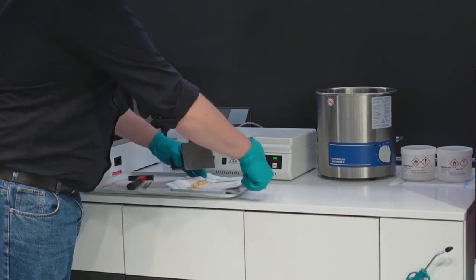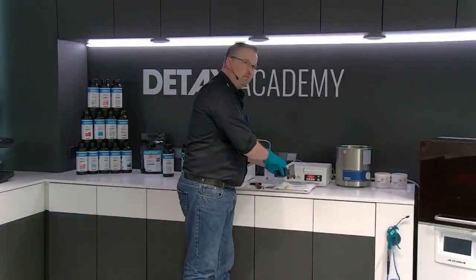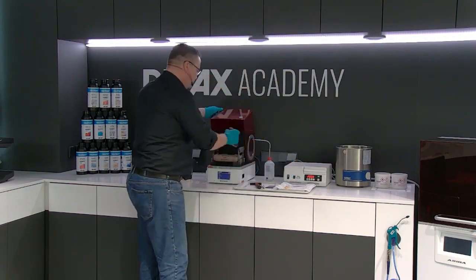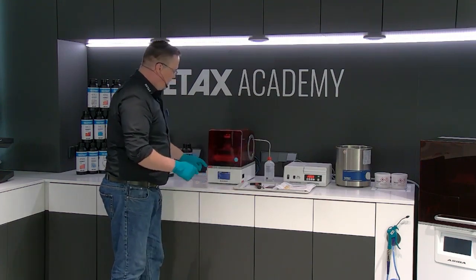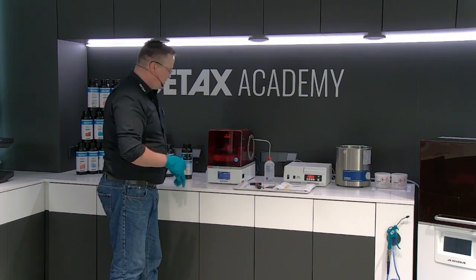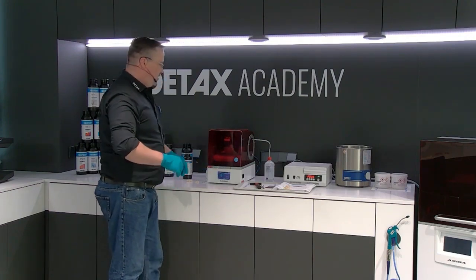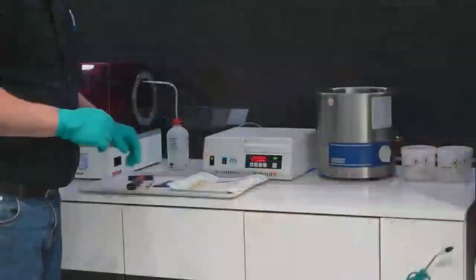If yes, we will print now the same material. That means we can use this platform without any more cleaning. Take it back to the printer, fix it, close the hood, and now we can start the next print job. The print job we prepared is just called webinar. Only follow the screen here, and the printer started and will be finished in about 45-50 minutes. About. Now, in the meantime, we can clean our printed parts.